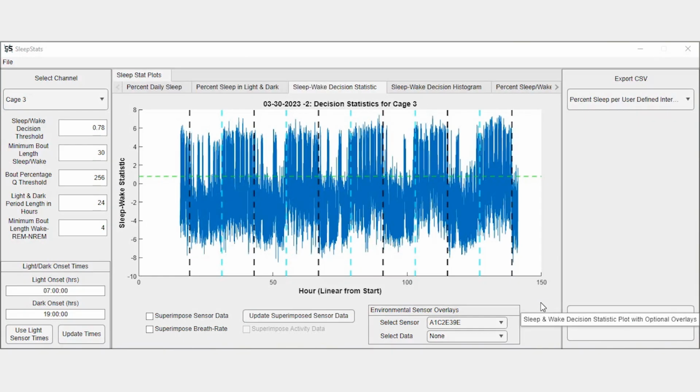The zoom and pan feature icons are activated when the mouse cursor is in the plot area. When selecting the zoom in option, the cursor should appear as this crosshatch when moved onto the plot area. If it does not appear immediately, move it off and on the plot area. For some PCs, there may be a delay depending on their processing speed and memory. Now, click and drag out a region of interest like so.